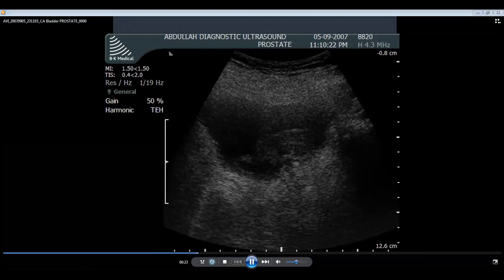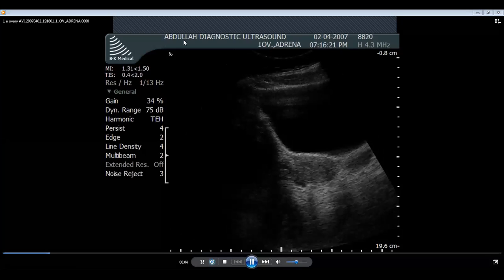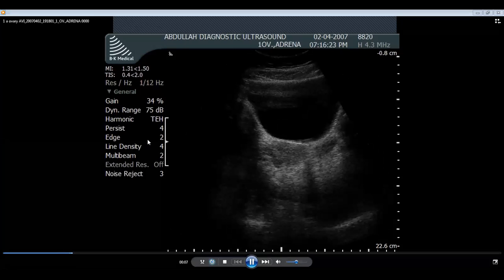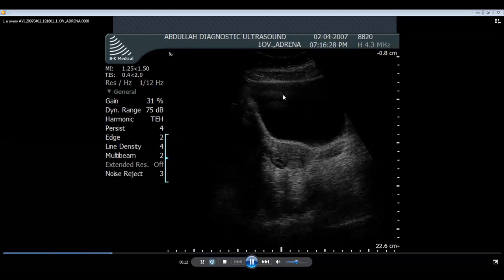This is going to be the last collection of videos for you regarding ovaries, in which we will see how the ovaries will appear with maturing follicles, immature follicles, chocolate cyst, carcinoma of the ovary, and a dermoid cyst. So let's start from the ovary. There we are, the urinary bladder.